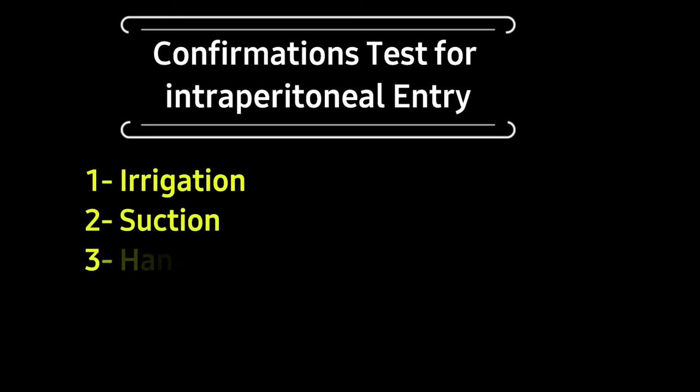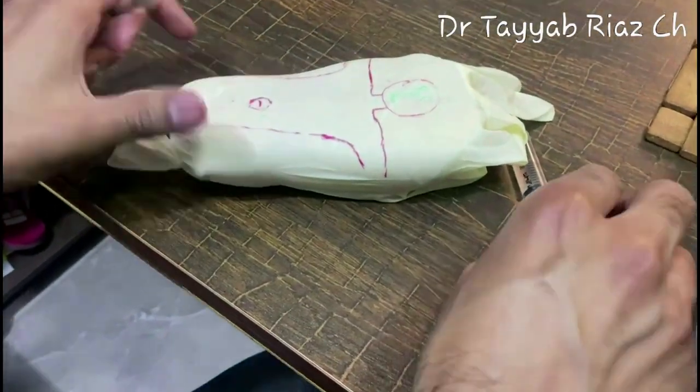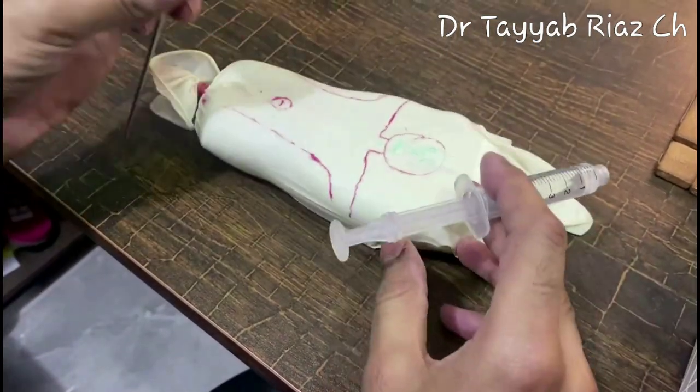While entering the Veress needle, we come across two resistant structures. One is the rectus sheath and the other one is the peritoneum. And there are two click sounds when we pass across these resistant structures, and also the safety stylet gets uplifted two times. So this is one way to know that we are in the peritoneal cavity. But still, if you are in doubt, then these four tests can be performed to confirm intraperitoneal presence.